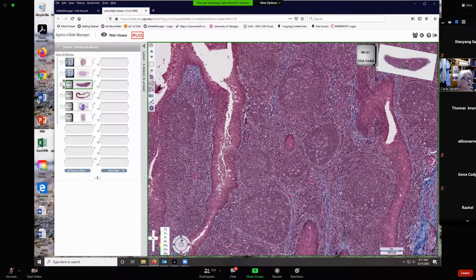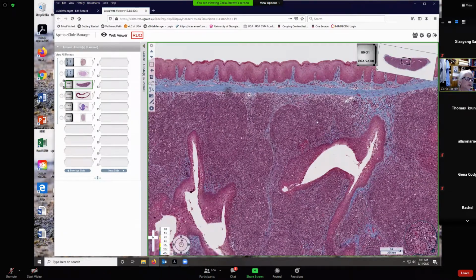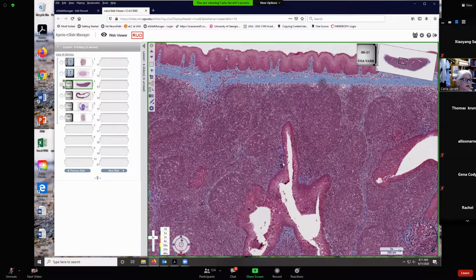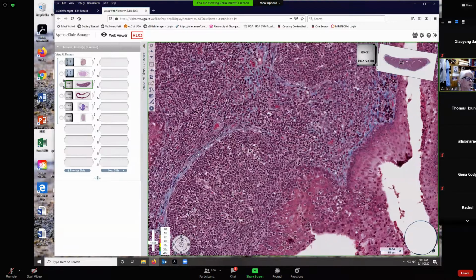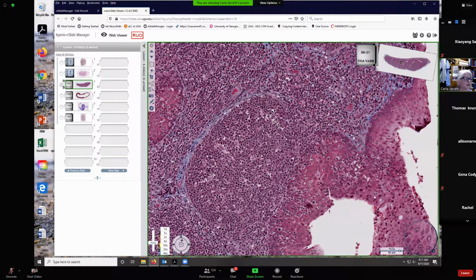Now, where is the diffuse? Well, just like the paracortex in the lymph node, the diffuse is everything that fills in around the nodules, and that would be your T lymphocytes, okay? So here's the diffusely structured lymphoid tissue, and that again is heavily populated with T lymphocytes. The nodules, the more organized lymphoid tissue, that's the B cells.